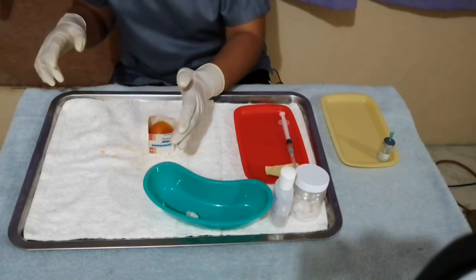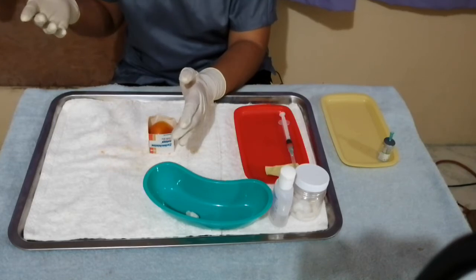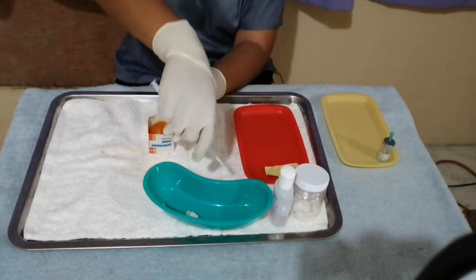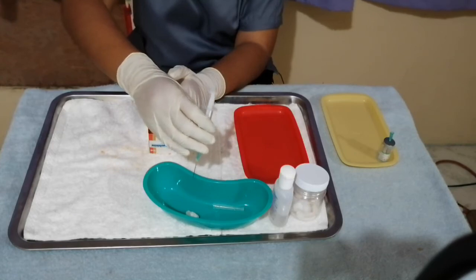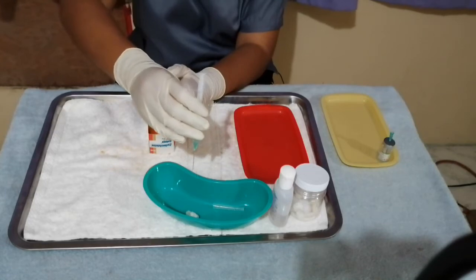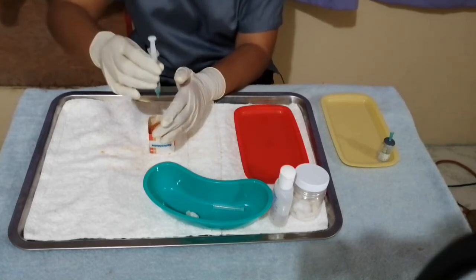Assuming that I already pulled the skin and have the prepared medication, we're going to insert the needle at a 90-degree angle to the skin while continuing to hold the skin with the other hand. So again, 90-degree.